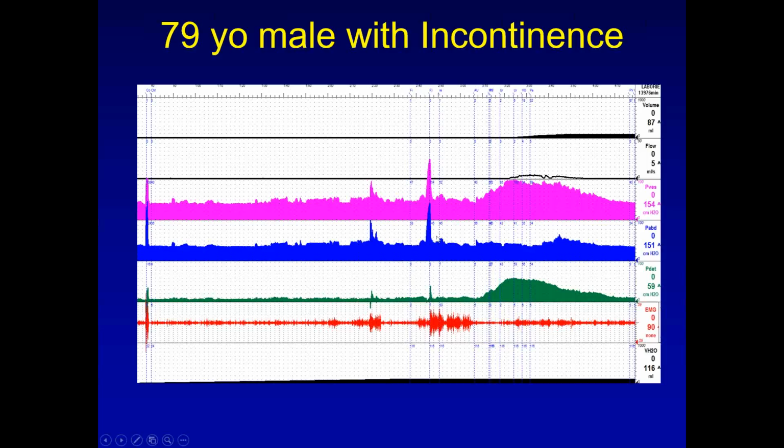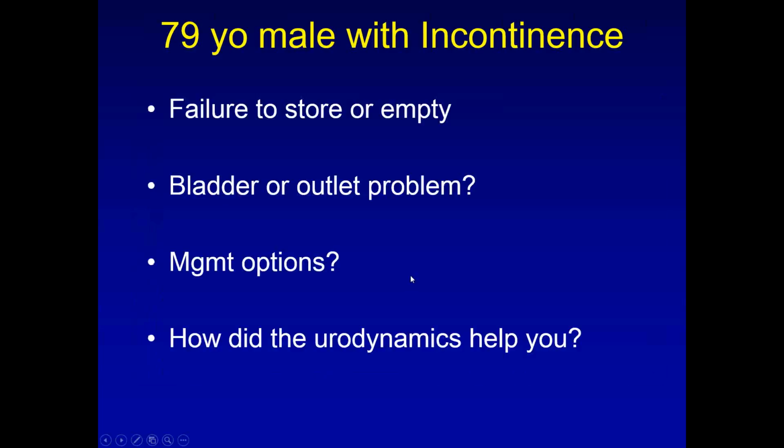He did not leak with this strain maneuver. You can see there's no leakage there. So is he a failure to store or empty? Is he a bladder problem or outlet problem?